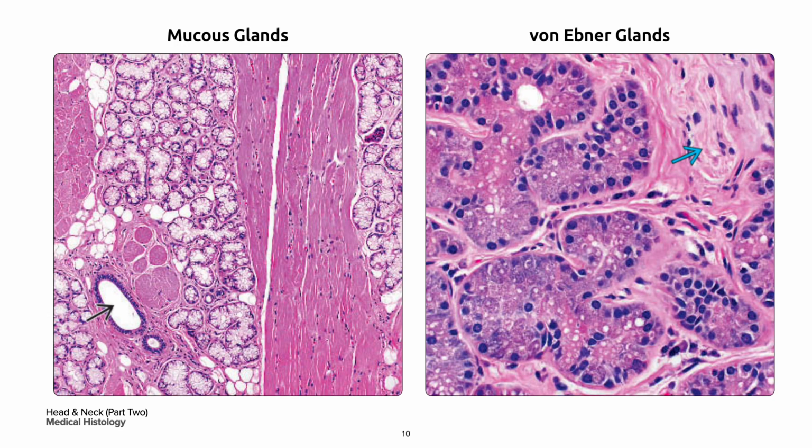On your left is salivary gland tissue, which is present in the posterior portion of your tongue, and these consist mostly of mucous gland lobules embedded in striated muscle. These lobules have a central salivary duct, shown in the single black arrow. These drain to the ventral tongue.